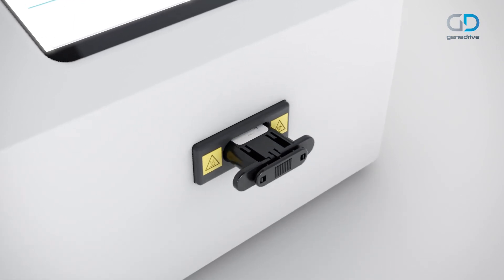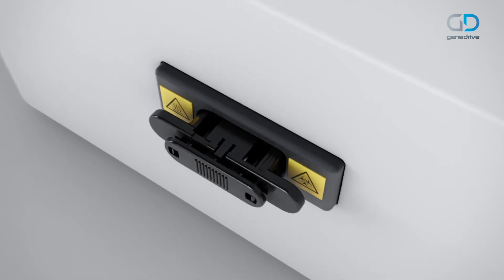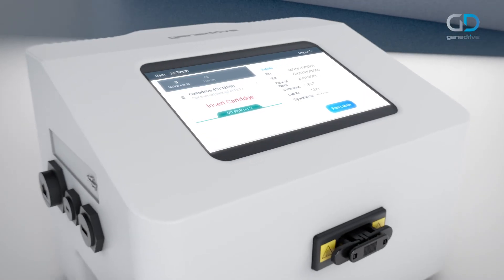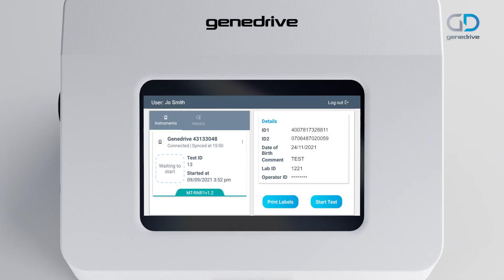Place the cartridge into the GeneDrive system. Push the cartridge firmly into the GeneDrive system until a click is heard. A beep tone confirms that the cartridge is valid. Press the blue start test button on the touch screen.